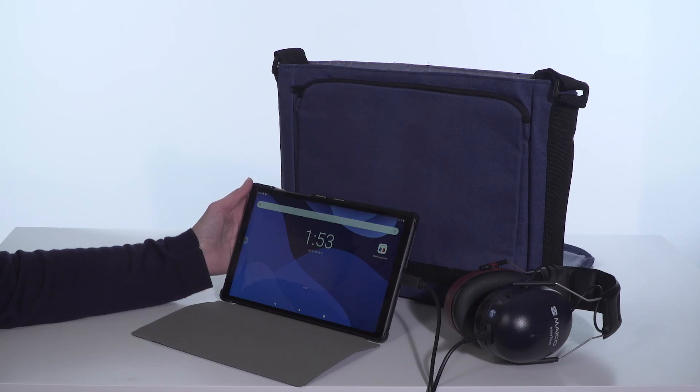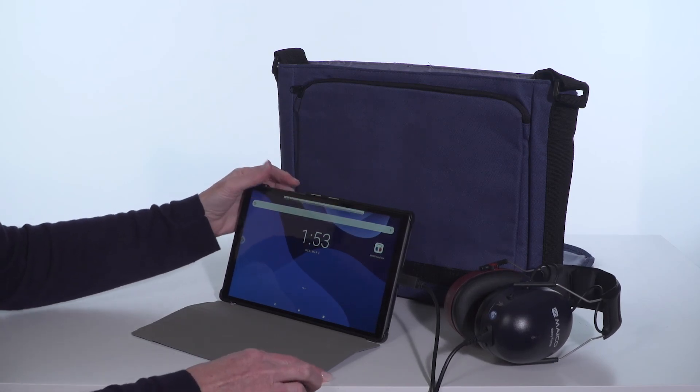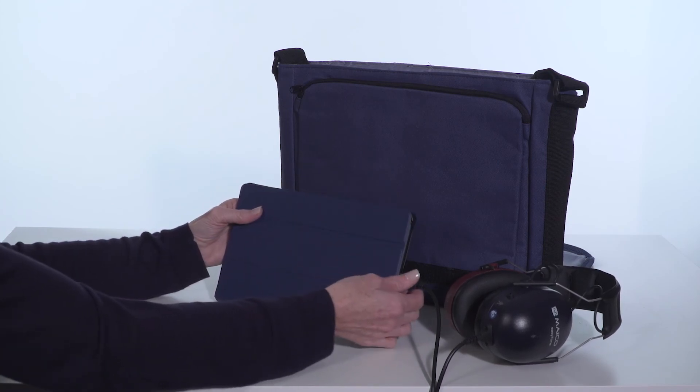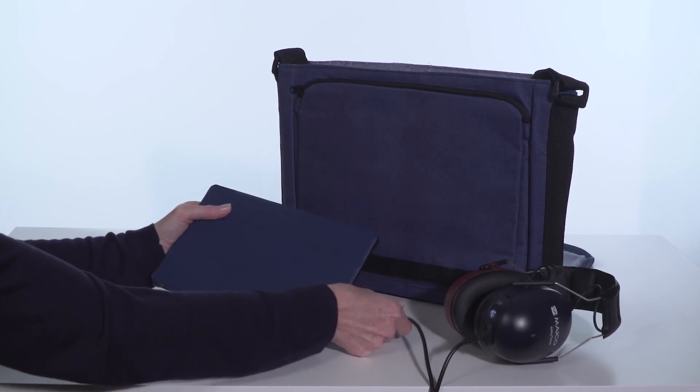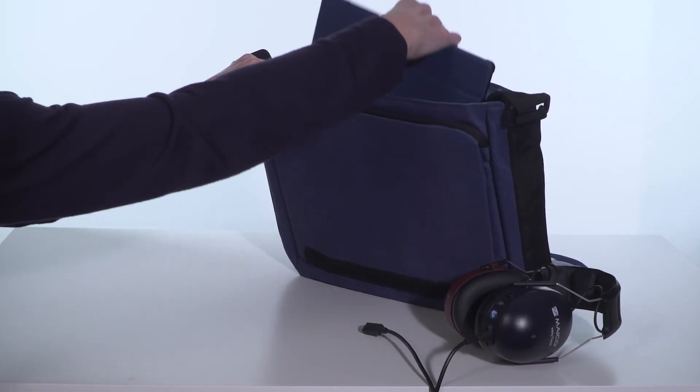When storing and transporting the device, turn the tablet off and unplug the headphone before packing. This will lessen stress on the cords and save on battery consumption.